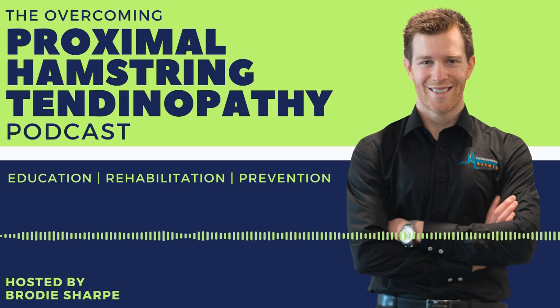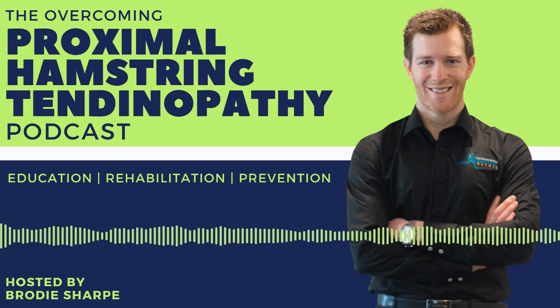And then if you are during the session getting some pins and needles or numbness down the leg, we should cease the Shockwave, change the location, or just try something else. So keep that in mind as well. So those were the points that I had written down. That's pretty much all you need to know on Shockwave.